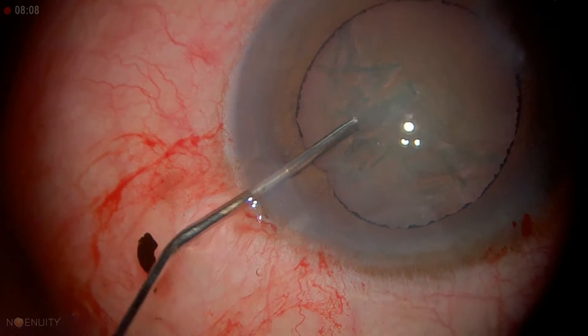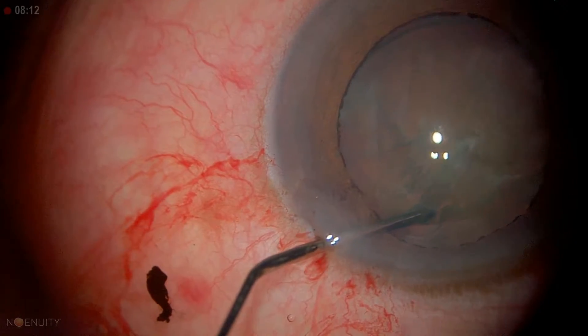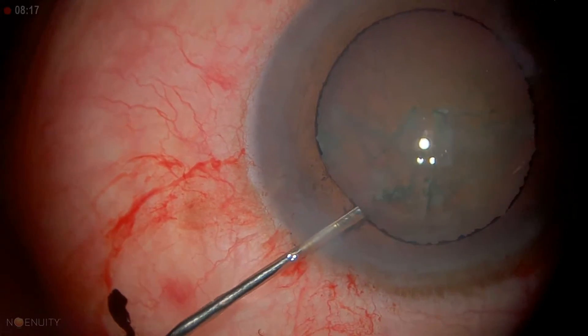Now we're going to try to turn. We do the sub-incisional. The lens easily turns. We can turn it again — so we're all ready.